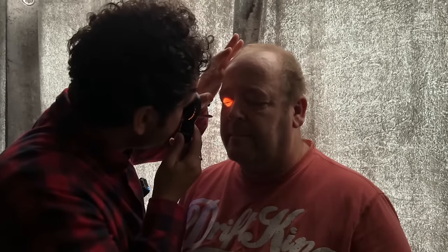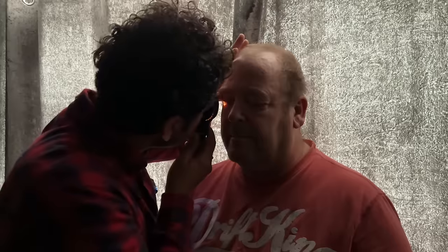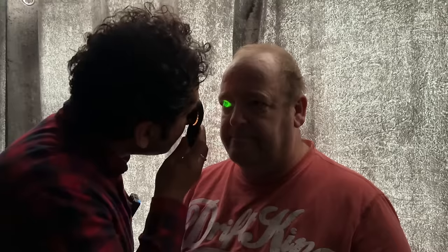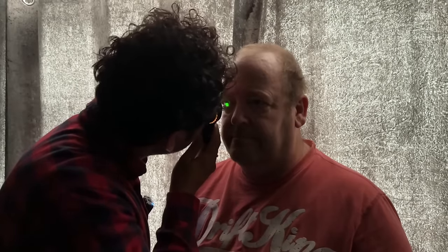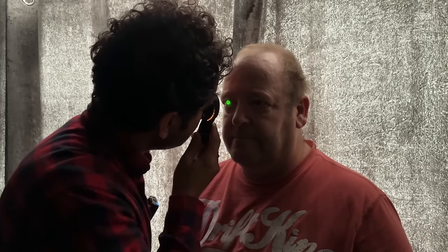Looking down and left, and down and right. Now I'm going to switch to the green light, which is known as red free. Just looking straight ahead again in the distance. Now this is going to allow us to visualise the blood vessels in better detail as they show up black against a lighter retina. And we can check the AV ratio and any tortuosity or nicking.